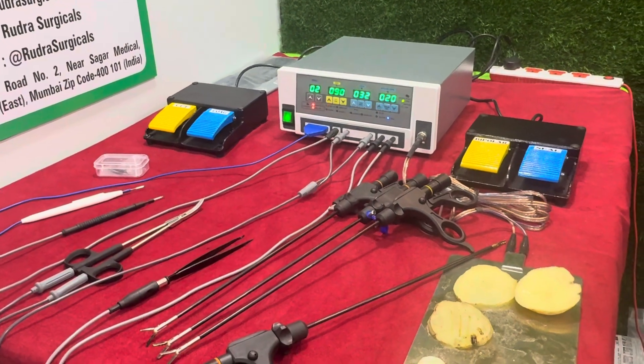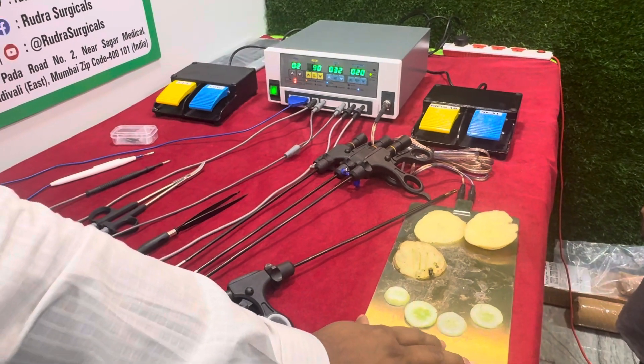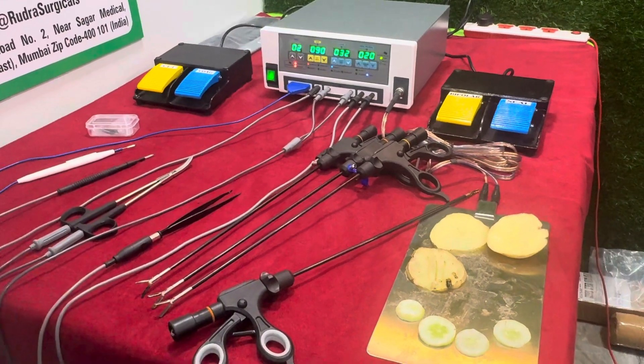This is the patient plate — a steel patient plate. Without this plate, surgery is not possible. The patient plate cable is autoclaveable.